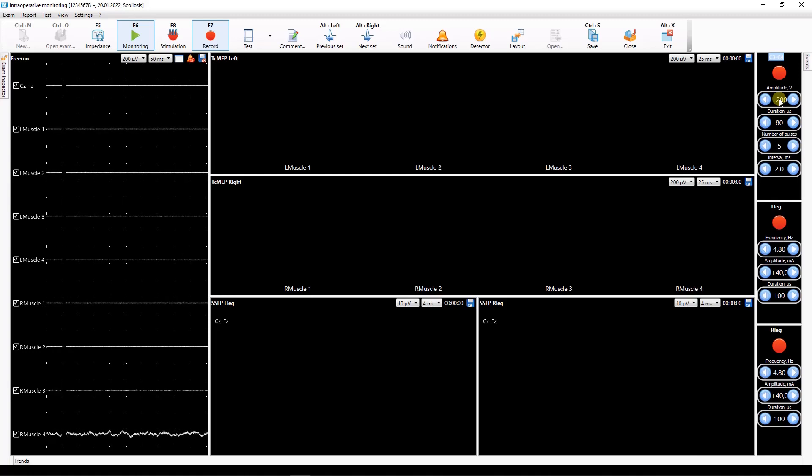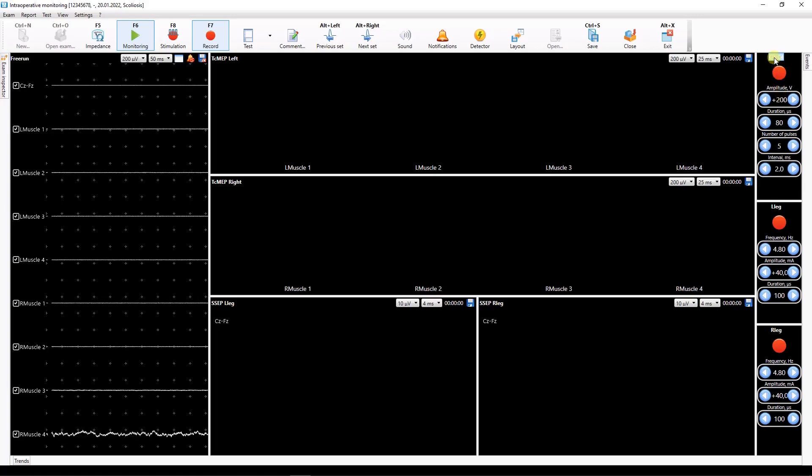To view and change all the possible parameters of the selected stimulator click on the line with its name.